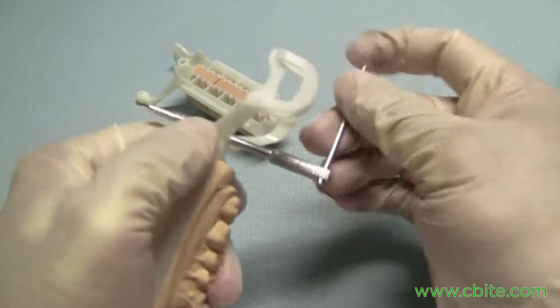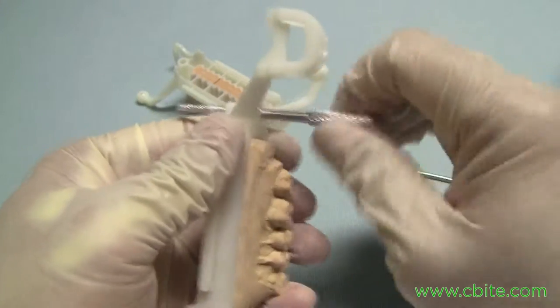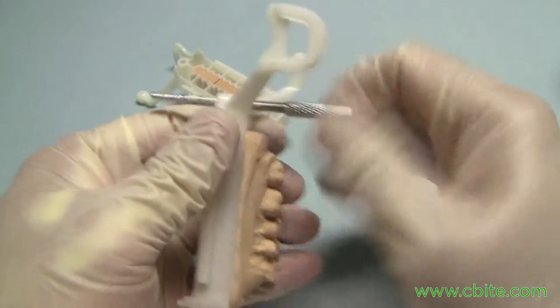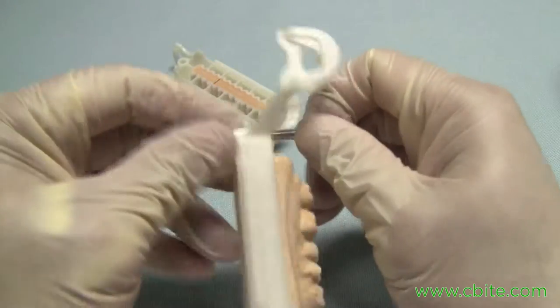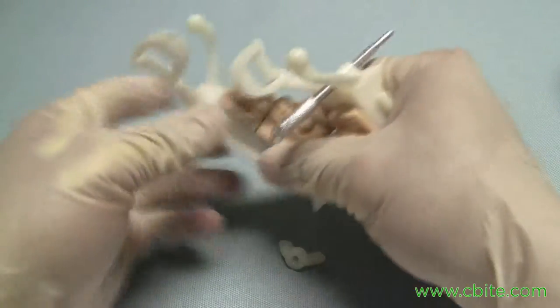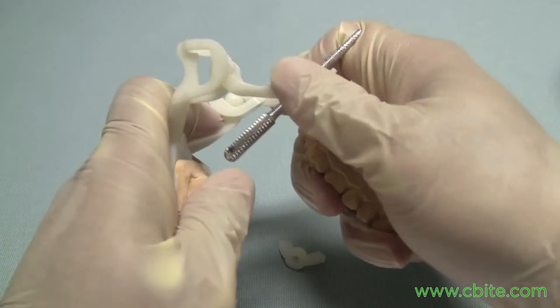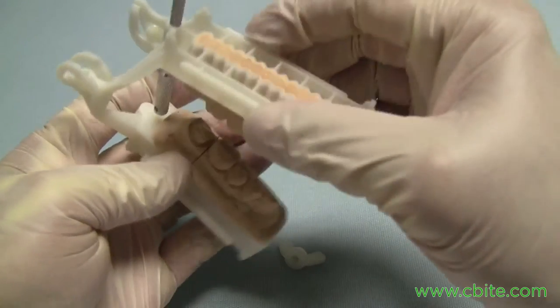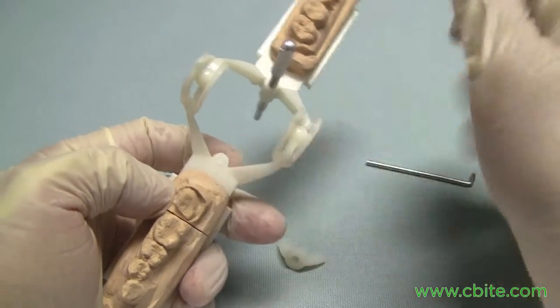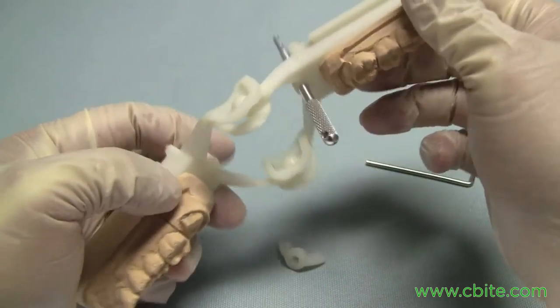Once it starts feeling good, you don't need the wrench anymore. Now on the opposing side, there's also a membrane there.